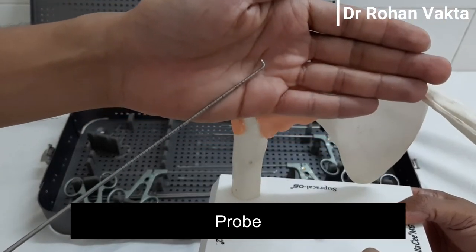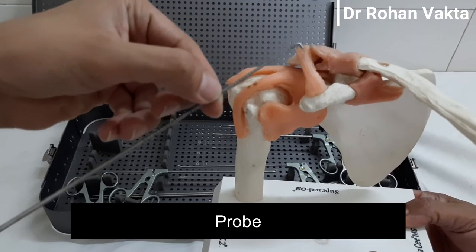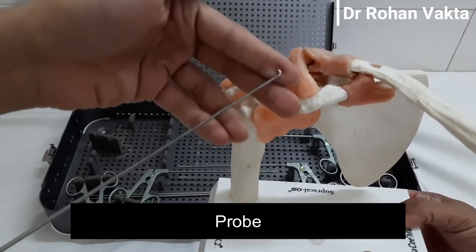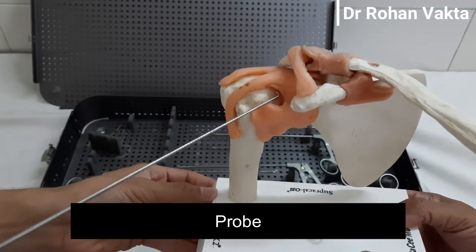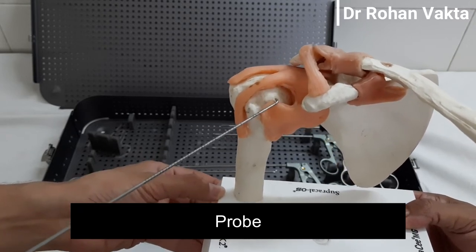This is the standard probe, which has around a 2–3 mm wide tip, and there are markings over the probe for measurement of the retraction of the soft tissue. Compared to the knee probe, the length of the shoulder arthroscopy probe is slightly longer.